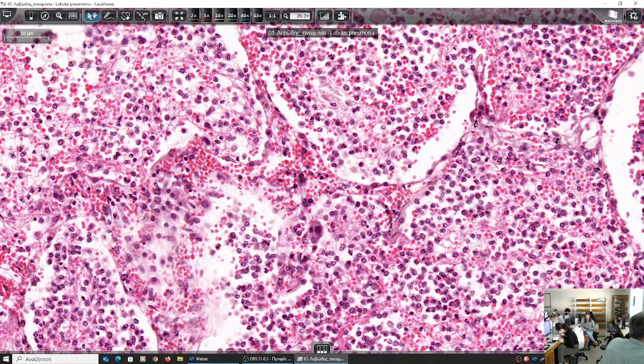This part cannot have air because instead of air, there is the inflammatory infiltrate of pneumonia in the air spaces. If this situation persists, you'll see in the blood the pressures of oxygen and carbon dioxide change, and respiratory failure, because the blood cannot receive oxygen any longer. Why? Because there is no air in a significant part of the lung parenchyma.